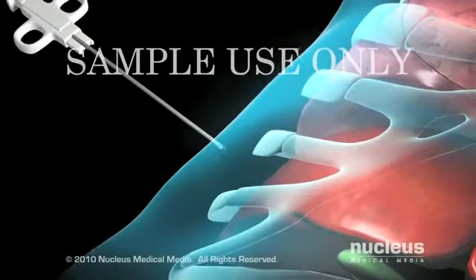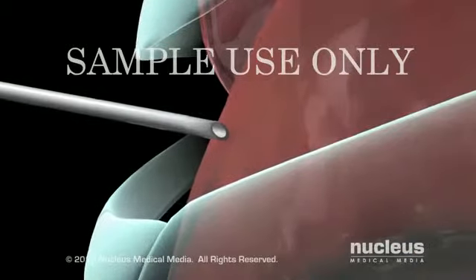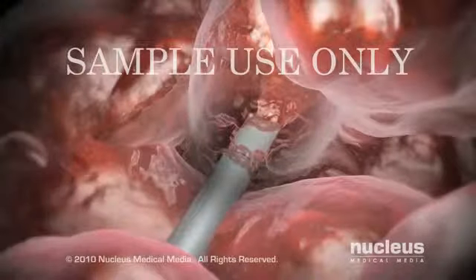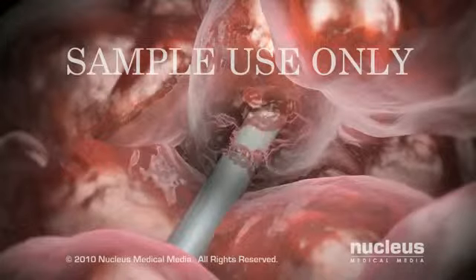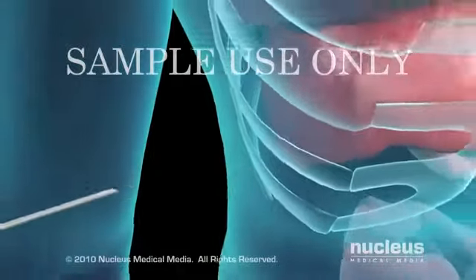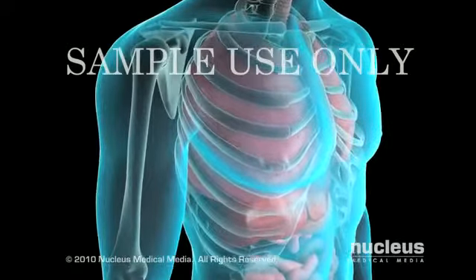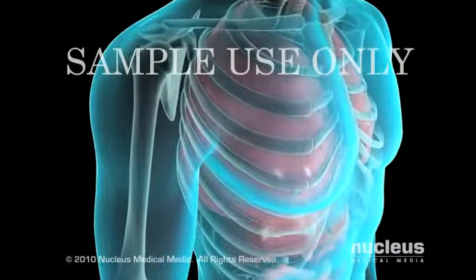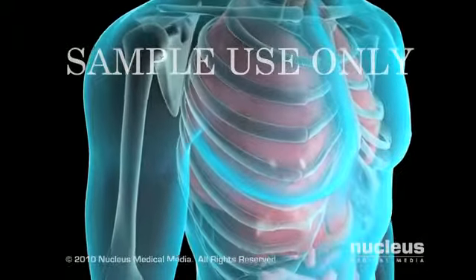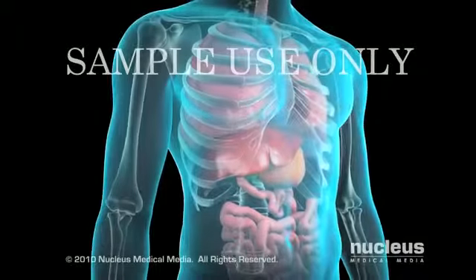Your doctor will carefully advance the biopsy needle to the surface of the liver. Your doctor will then ask you to hold your breath while he or she advances the needle into the liver and obtains the tissue sample. As soon as the biopsy is obtained, you will be able to breathe normally. You may feel a momentary sensation in your right shoulder during or just after the biopsy. Some patients have pain that requires additional medication, which is provided by your doctor if needed.